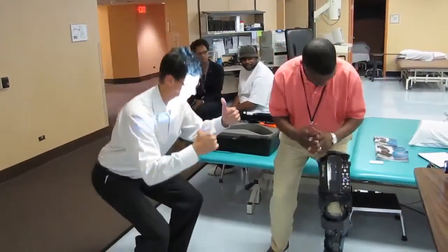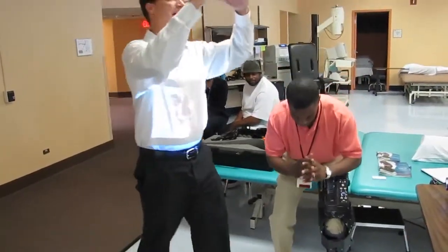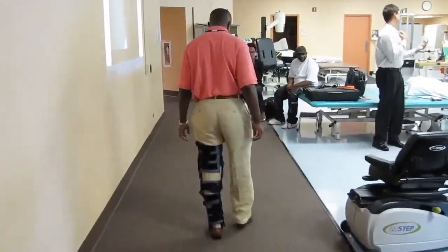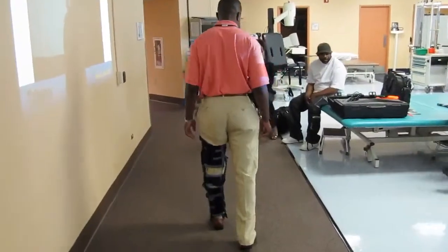So we'll do it one more time, and you can really sit down into it too. I mean, this thing will bend down — you could bend down past 90 degrees. It provides no resistance in flexion, so it allows the patient to flex their knee in swing phase.